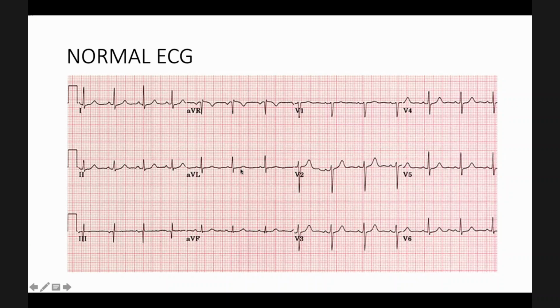Sometimes people put the limb leads in the wrong way: the left lead goes on the right side.